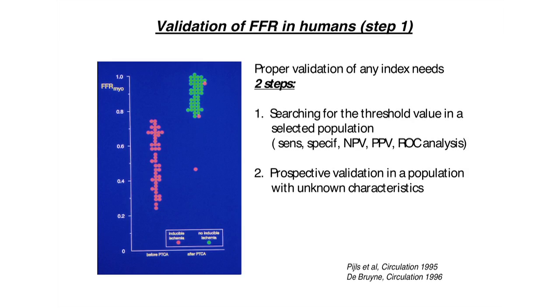In these patients, we did a PCI. We repeated all the tests after the PCI. And if the patients do not have complaints anymore, and if the exercise test turned to normal, you know that there is no ischemia anymore. And these are the results for that first step of the study.